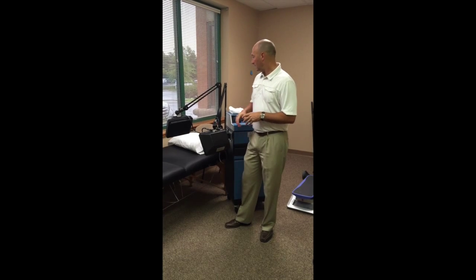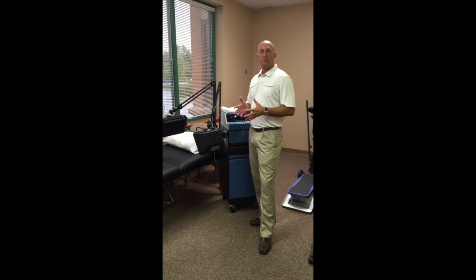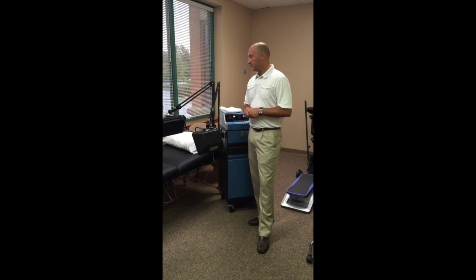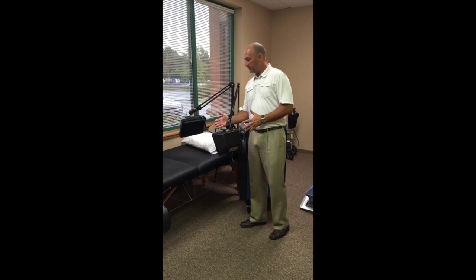And also that we apply some form of cotton towel, or if the person has a cotton shirt or clothing on, to absorb some of the moisture, because electromagnetic energy definitely has a tendency to heat up water molecules, and so that will get much warmer than the tissue that we're trying to affect. So with this unit, the energy travels from here to here.